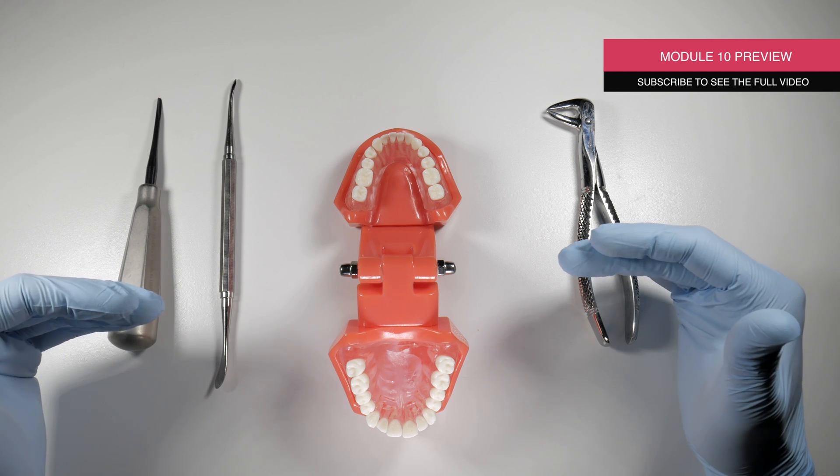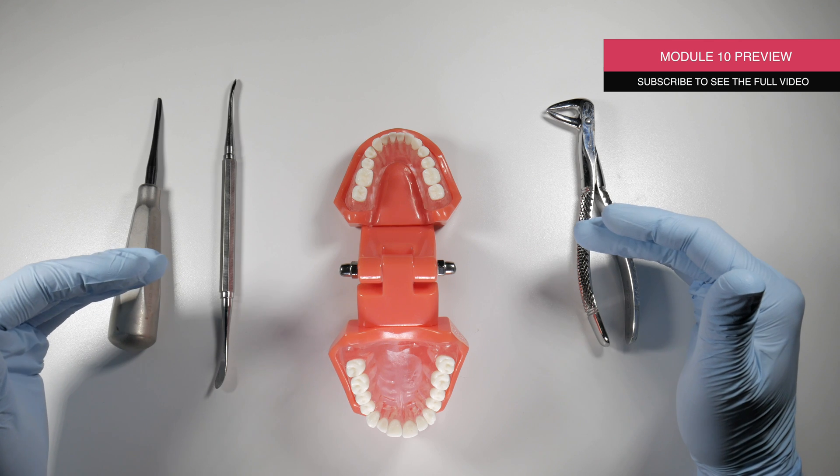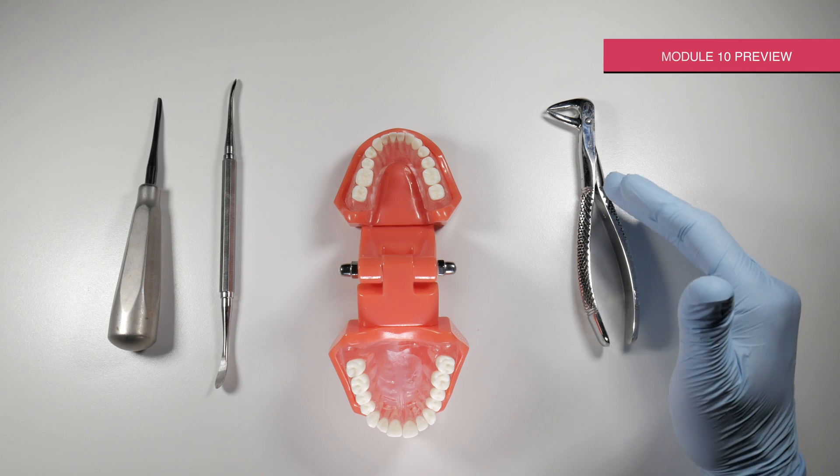We'll cover that in other videos. This video is about the 95% of the time where these teeth are a little more straightforward to remove. We're going to give you some tips for how to do it, and I'll show you how I do it in my practice.